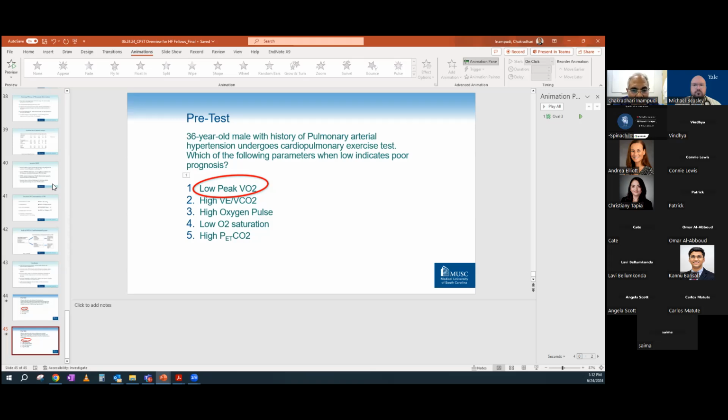And another area that I also use, as I mentioned before, for all patients, because I manage patients going through cardiac risk stratification for abdominal transplant, I actually perform CPET compared to the standard NYHA functional class assessment that we do for patients. Peak VCO2, more importantly, the VO2 at the anaerobic threshold. The VO2 at the anaerobic threshold, less than 10.4, indicates high risk of cardiac outcomes and longer hospitalization for patients with abdominal transplant.